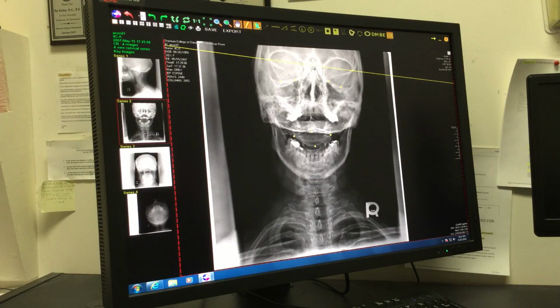And so I'm going to grab this line and scroll it down through the lower sets of points to see if it aligns with each of these anatomical sets of points. It looks like the superior baseline that I've created aligns well through my most superior set of points and also through my most inferior set of points. So that means these two sets of points are symmetrical to each other. And we can see that the superior baseline does not go through the second or middle set of points. So that means that second set of points is asymmetrical to the rest of the skull.